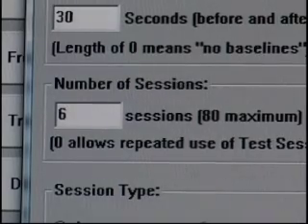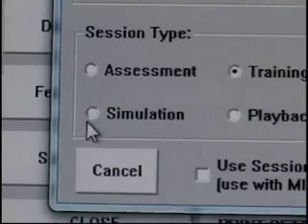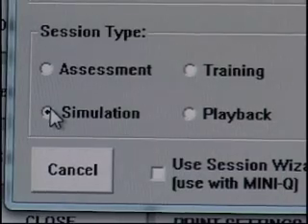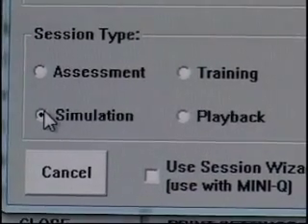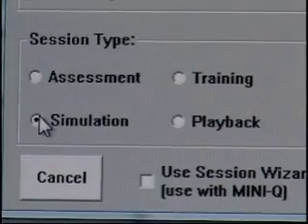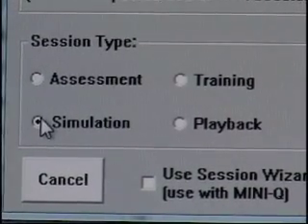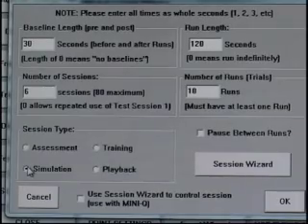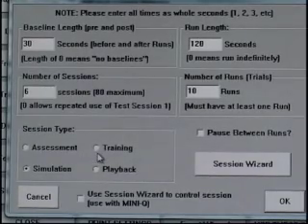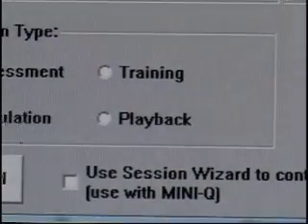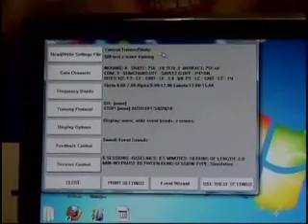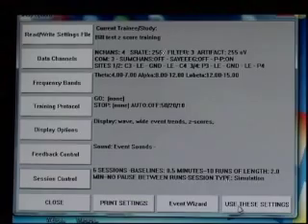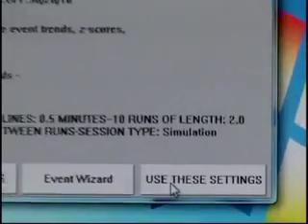For this particular exercise, we're going to use simulation in the lower left-hand corner because I am not planning to actually put electrodes on somebody's head. I just want to take a look at the protocol, see that it's functioning on screen, and have a random noise signal pumped in that I can still filter to look reasonable for EEG — so I can test my feedback, maybe change some sounds, things like that. When you're actually training a client, of course, it needs to be on training. Again, we hit OK, and at this point we've created a settings file for this client and they're ready to do their Z-score training. We always move to the next screen with 'Use These Settings.' Thanks.